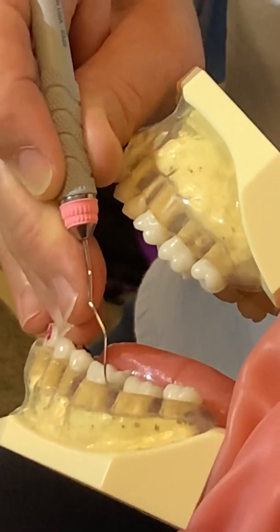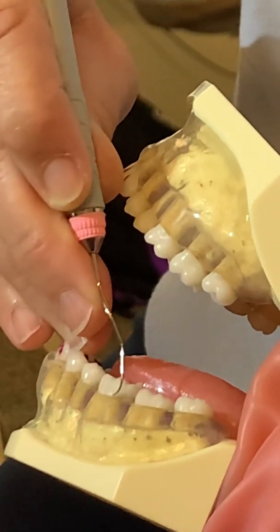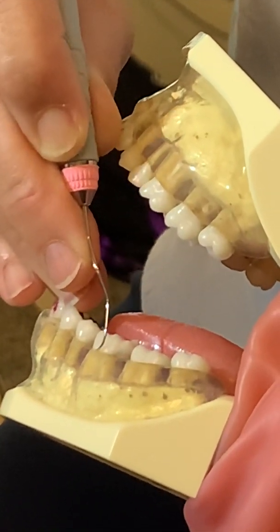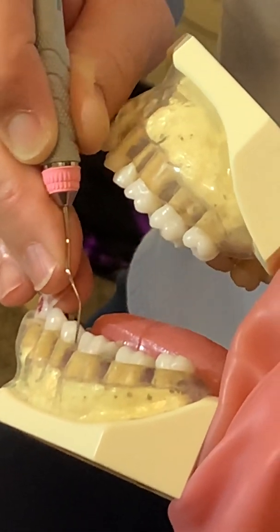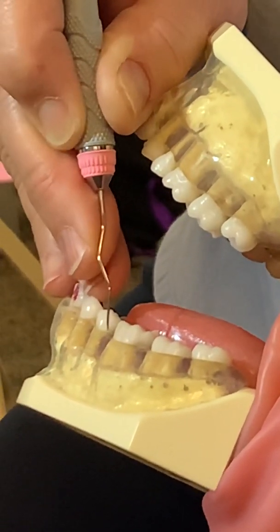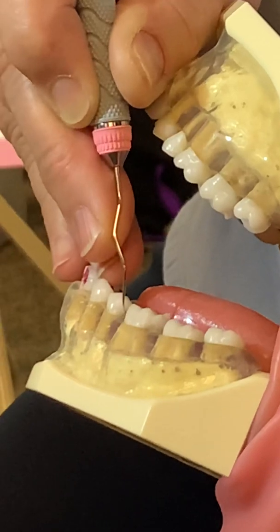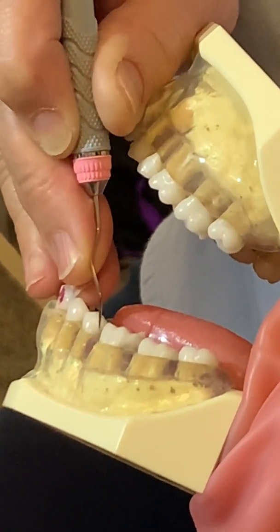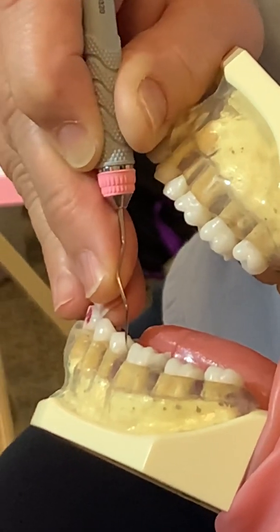Lift it out. Roll it with your fingers, but lift your elbow a little and it'll help you. Just under the tissue. And then bring your elbow down and go into the mesial. Get all the way to the mid-proximal and then go up and down 5 times. Okay, so let me show you what the whole thing looks like.